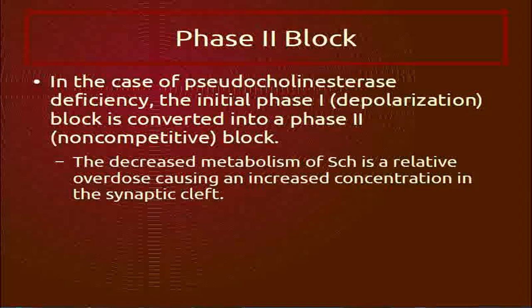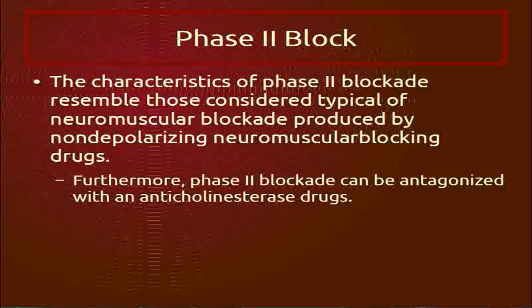One thing's for sure. You gave too much succinylcholine. Either you bolused too high, or there is some type of problem where the patient can't metabolize it, or you ran a continuous drip like they did in the old days, but there's too much succinylcholine around. So this is going to look like a non-depolarizing block in the fact that the 4th twitch magnitude will be less than the 1st twitch magnitude on the monitor.